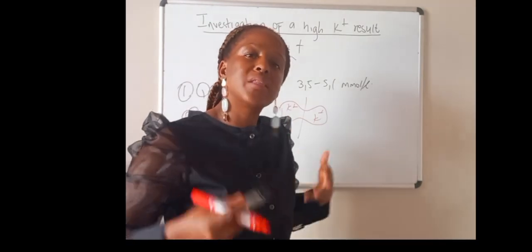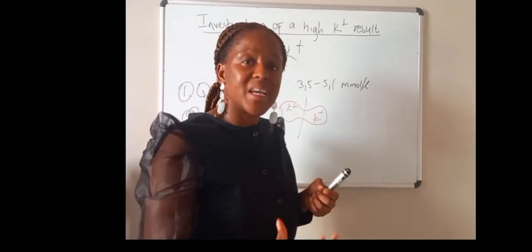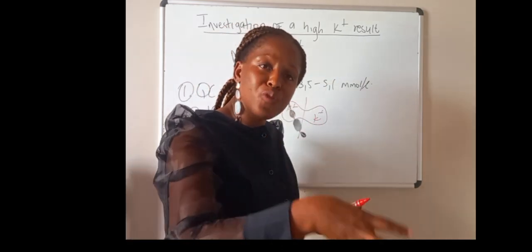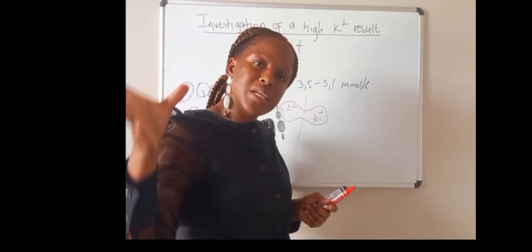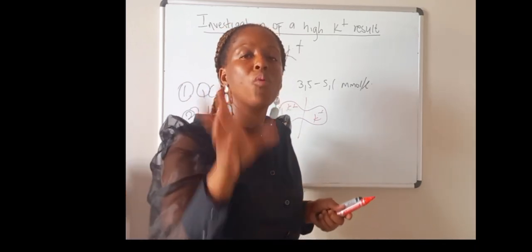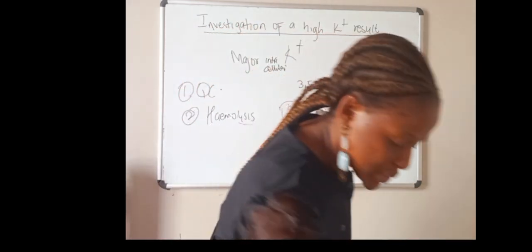It is just high in that tube, because the blood we've taken from the patient is hemolyzed, and the potassium in the red cells has moved from intracellular to the extracellular fluid, which is your serum or plasma, that we are measuring.